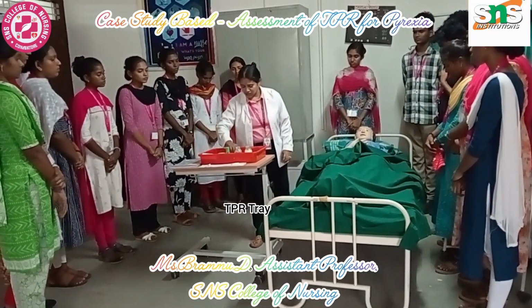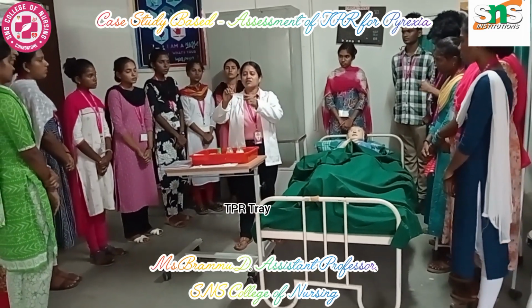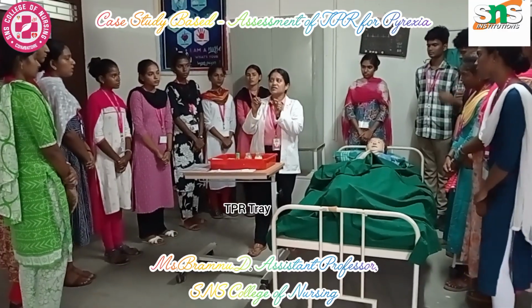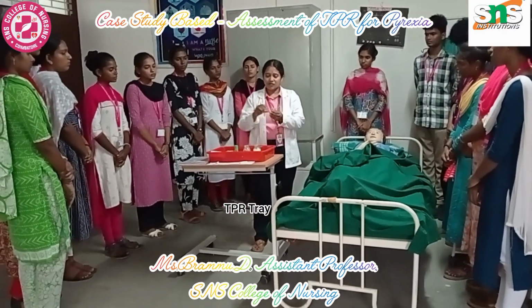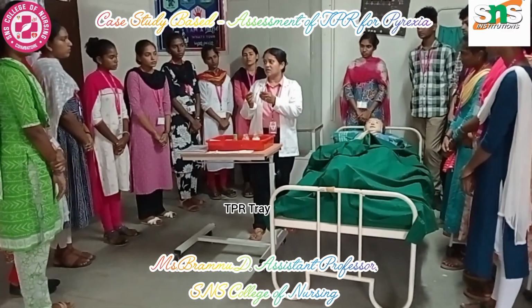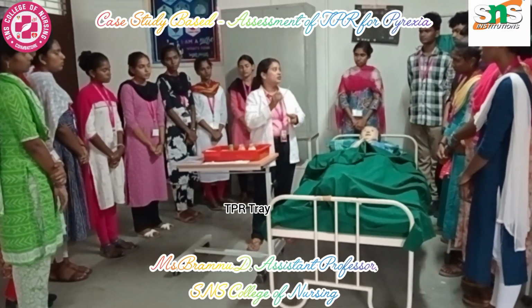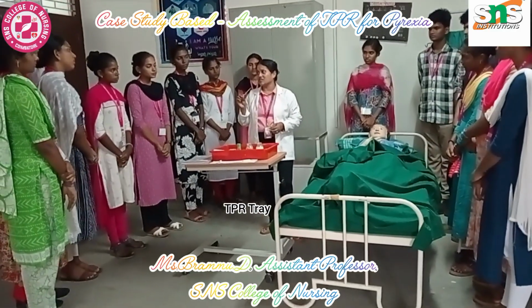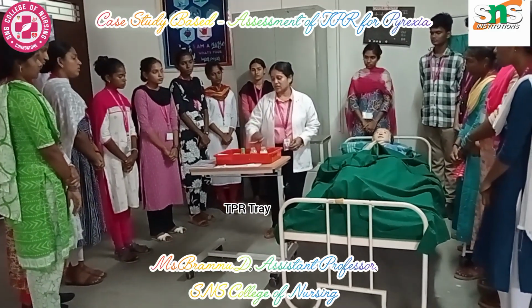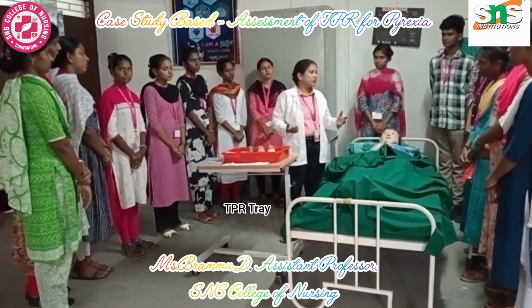In the rectal thermometer, the major difference is this one that I have brought. Here, the rectal thermometer bulb is very small and not pointed, whereas in an oral clinical thermometer, you can see the mercury column is much lengthier compared to the rectal one. Rectal thermometers are mostly used for pediatrics, especially children less than 6 years of age. Is there any doubt till now? No. So this is how we do the procedure.